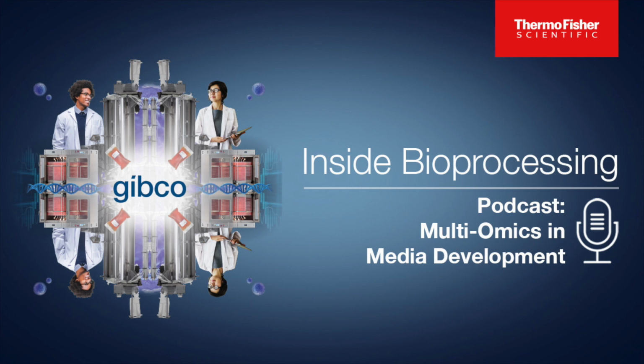And all of that now gets to a point where using a simple program like Excel is just not going to cut it in terms of being able to do this type of analysis. You really need to go to a higher level of data analysis to do this. And so this is where data science can really come in. There's been a lot done around being able to get good identities of what these proteins are and quantification around it in terms of data science.